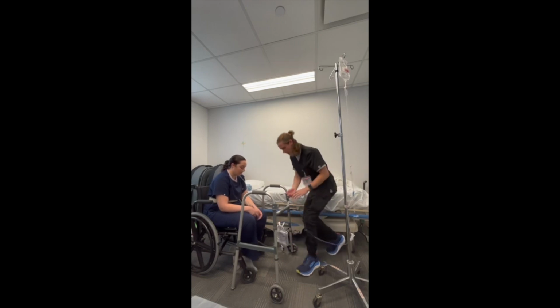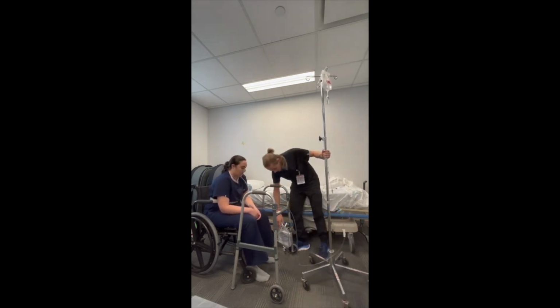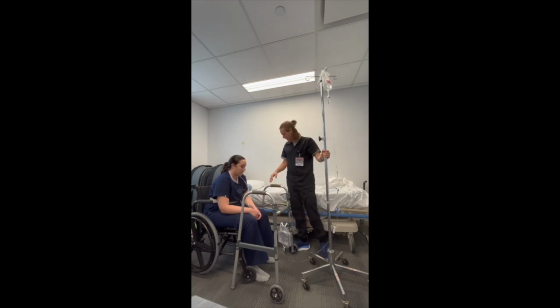Okay, how's that feel right there? Okay. So we've got our IV pole running out in front. We've got a pivot point out in front of us. This is going to be running out in front and a little bit to the side. Again, think of that as our pivot point. Make sure that we keep that in mind.